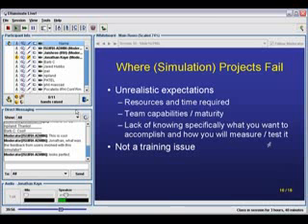Another thing here is in terms of how you're going to test it. Sometimes I hear people say, well, I want the student to understand how to operate the controls of the ventilator. That kind of goal, being really fuzzy and vague, is just not possible to test. You can't measure their ability to, in a general sense, operate the equipment. So you really have to drill down to details, and as trainers, and really as instructional designers, we have to take responsibility for what it means to be proficient.